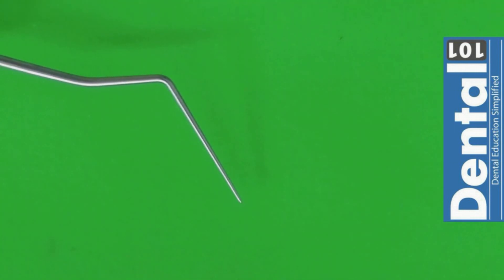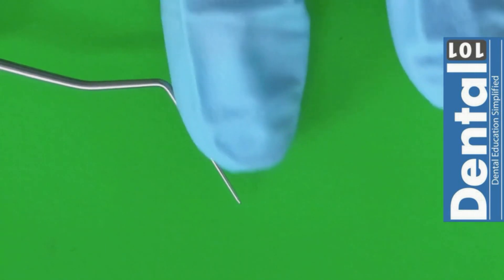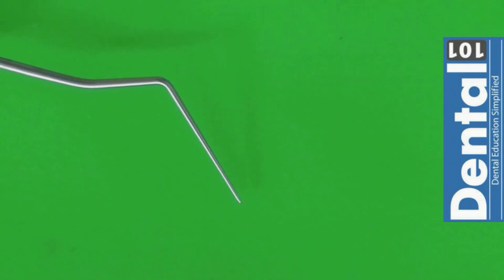This instrument is the endoprobe. It has two working ends. Both of them are pretty much the same. It is undulated like you can see here because it is going to help you localize the canals when you are doing an endo access or an endo opening. And also it is going to help you check the straight line access into the canals when you are doing the endo access task.